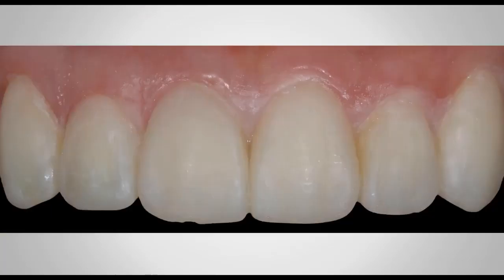What do you end up having? This is what you end up having. Now this photo was taken immediately after I completed polymerization of the flowable composite. I haven't used any type of burrs. I haven't removed any of the flash.